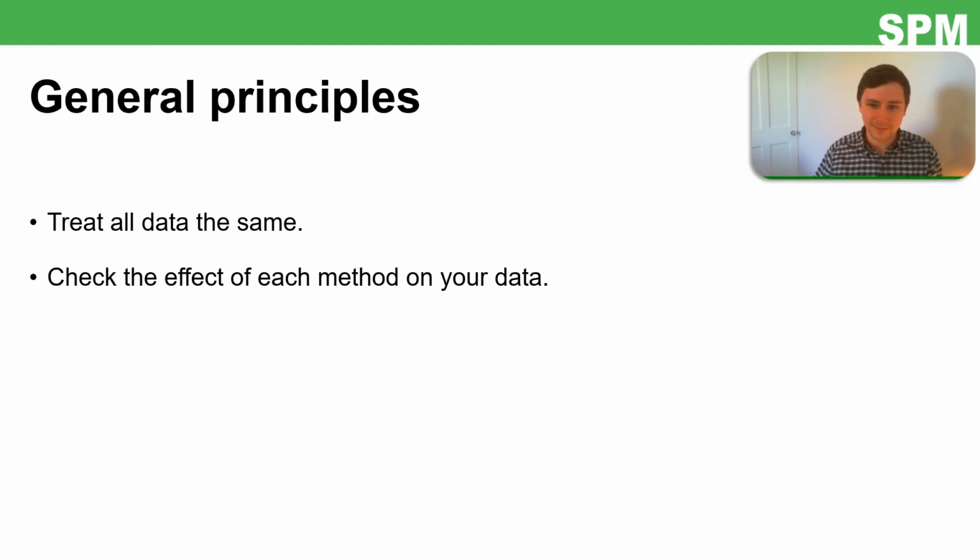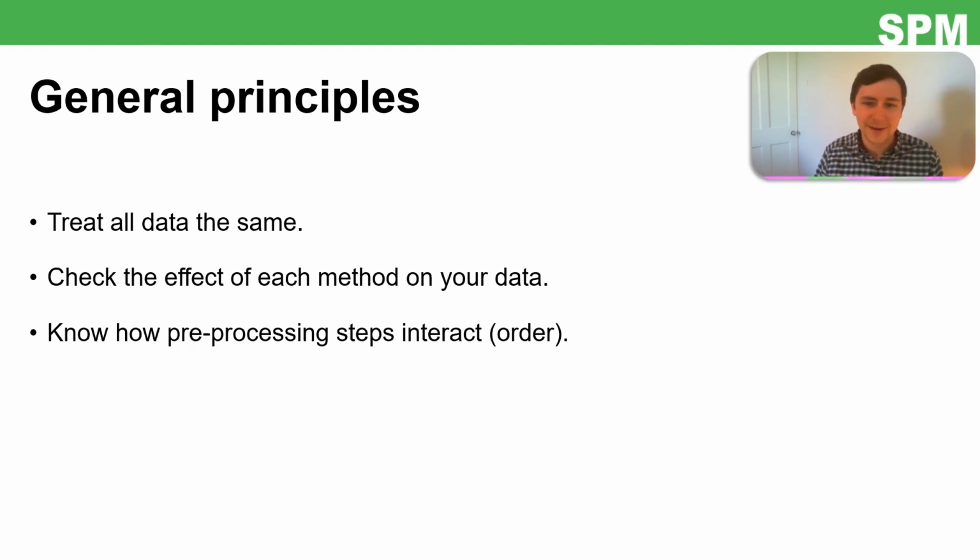Be familiar with it. Apply a filter to your data. Plot it again. See if it makes sense. That's nice, not just so you know what you've done, but also to check you haven't made a mistake. Maybe in the GUI you added a 0 where you shouldn't have, and you've got a 10 Hz, not a 1 Hz high pass filter. So that's a good idea generally.